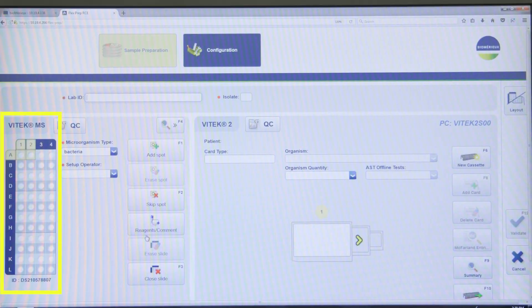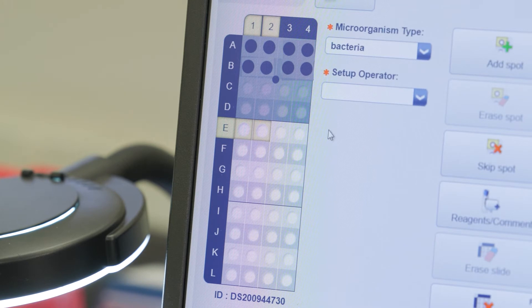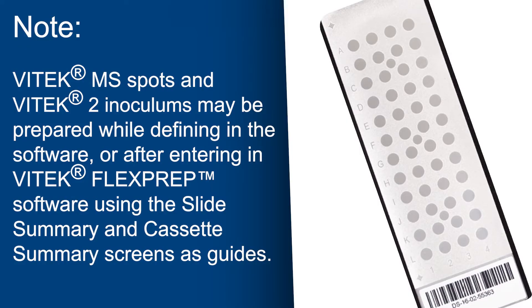Click OK. A graphical representation of the slide appears. Acquisition groups on the slide which have been previously acquired will appear in gray as they cannot be used again, even if empty spots remain. Note, Vitec MS spots and Vitec 2 inoculums may be prepared while defining in the software or after entering in Vitec FlexPrep software using the slide summary and cassette summary screens as guides.